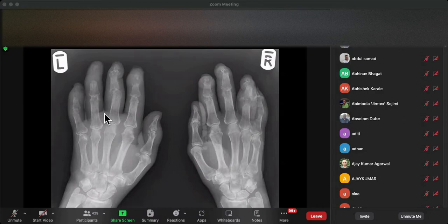What's the treatment of an omental infarction? Nothing really. Just leave it. Give them paracetamol, non-steroidal anti-inflammatory drugs, and just leave the patient. Okay. And it tends to get better. This is gout. Yeah, we've got juxta-articular erosions, very, very marked erosions. And don't forget, the soft tissue swelling tends to be dense in gout because the uric acid gets impregnated with calcium.